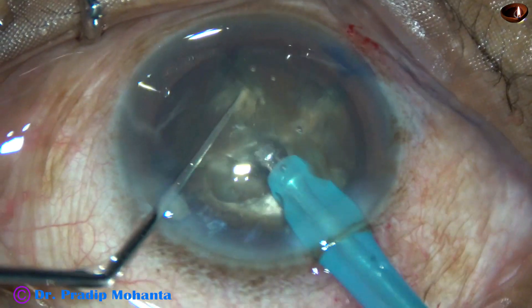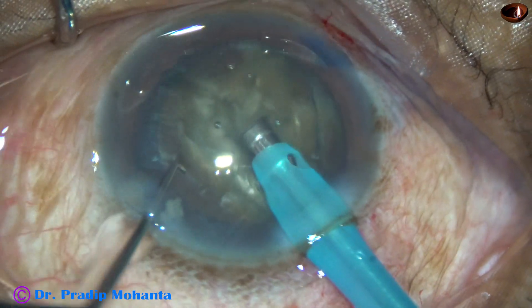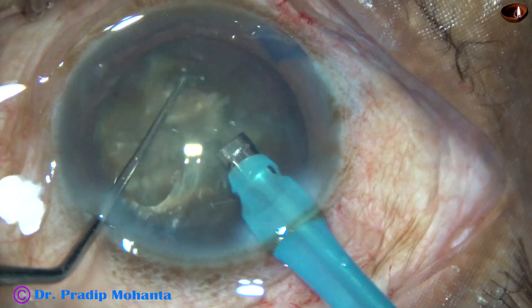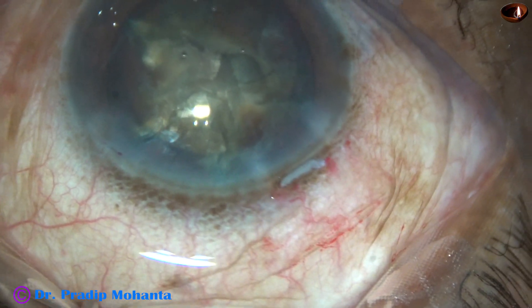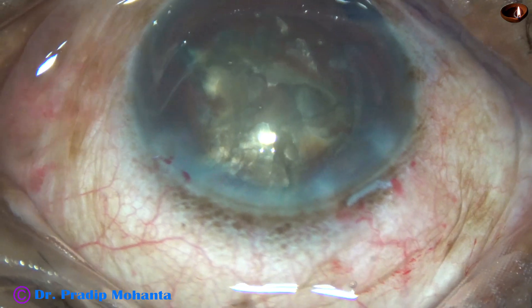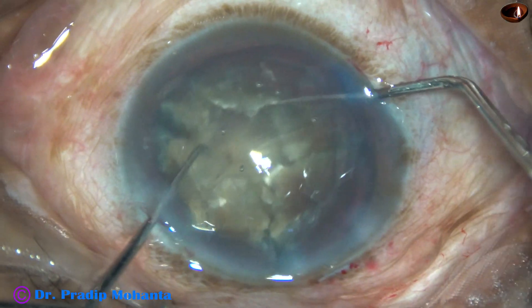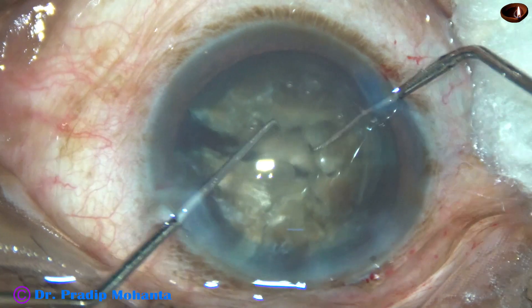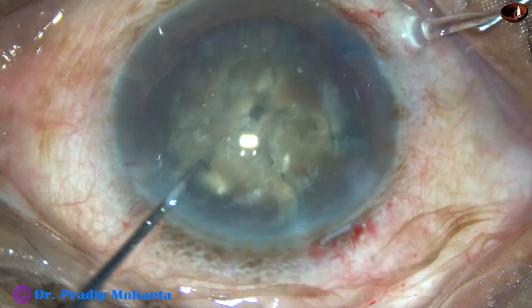But none of the pieces is free. Now as I try to rotate the nuclear mass, it is giving me some resistance — it is not rotating freely. Whenever it is not rotating freely, I come out, as there is something maybe wrong. So I inject visco and with the help of two Sinskey hooks, I am going to see what is happening. The two heminuclei have got separated. The leathery band joining the two heminuclei has given in, and the two heminuclei are free.